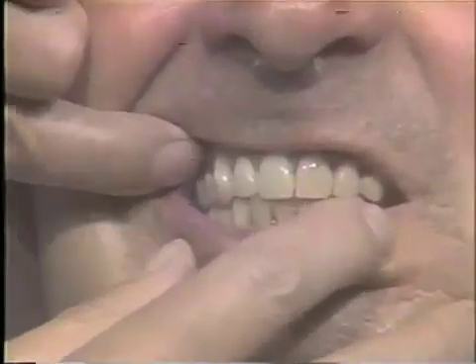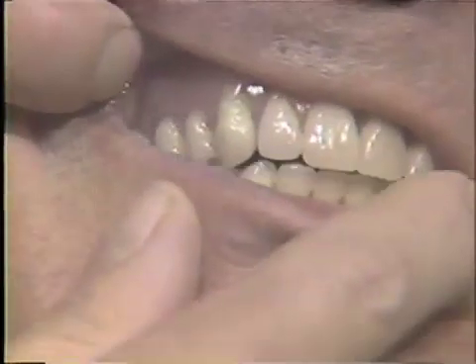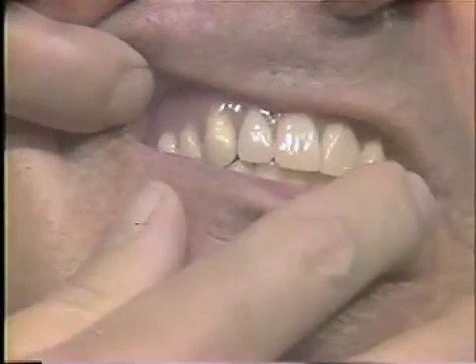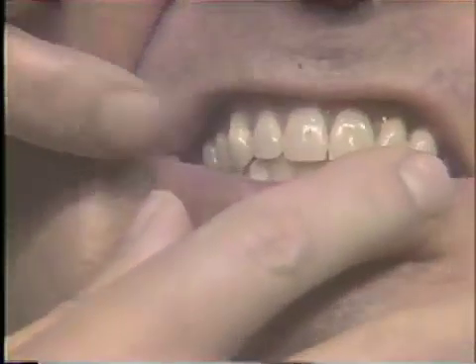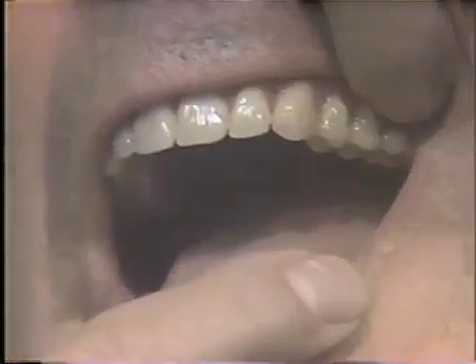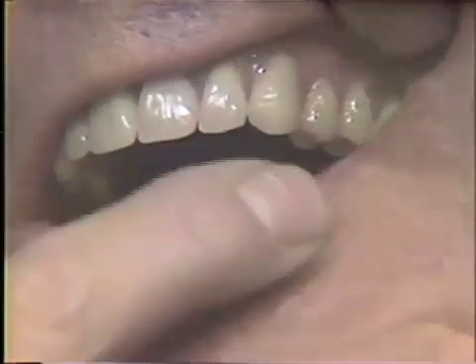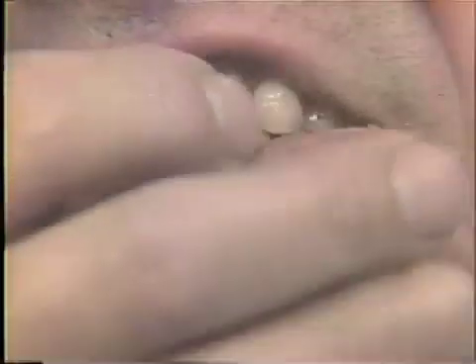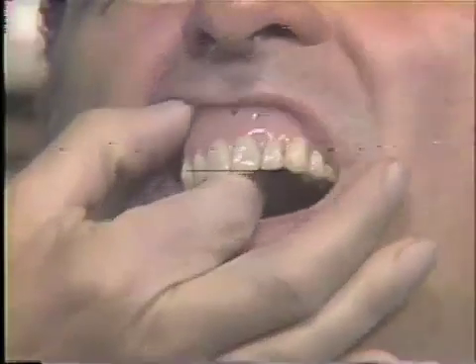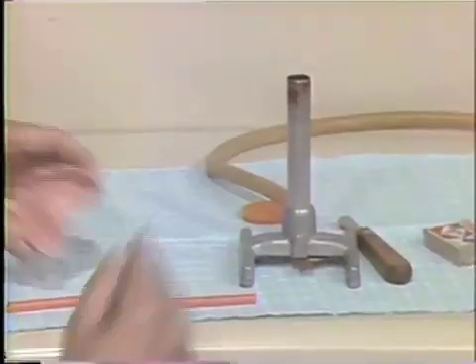The first step would be to adjust the occlusion. After the occlusion is adjusted, you'll develop a functional posterior palatal seal.